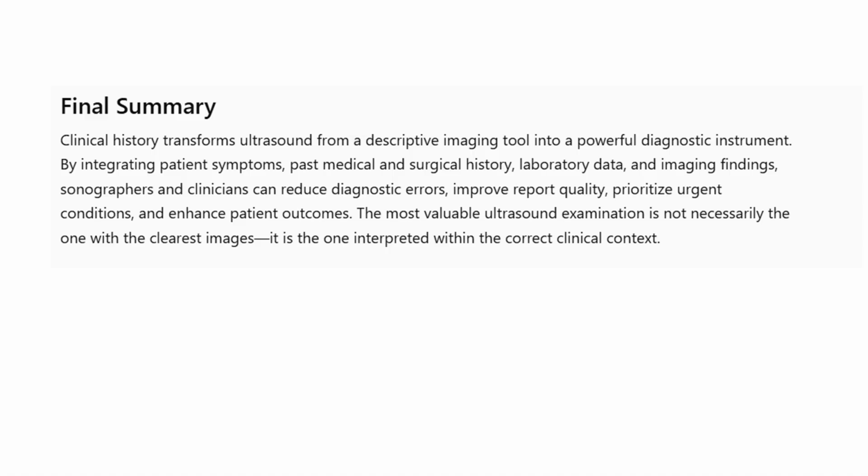So the final summary: clinical history transforms ultrasound from a descriptive imaging tool into a powerful diagnostic instrument. By integrating patient symptoms, past medical and surgical history, laboratory data, and image findings, sonographers and clinicians can reduce diagnostic errors, improve report quality, prioritize urgent conditions, and enhance patient outcomes. The most valuable ultrasound examination is not necessarily the one with the clearest images. It is the one interpreted within the correct clinical context.